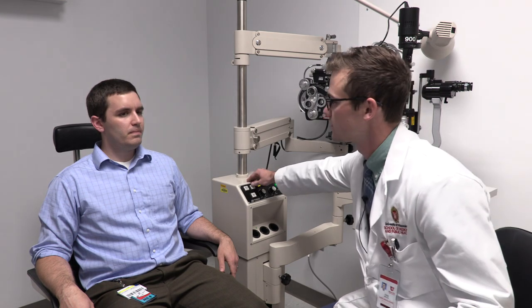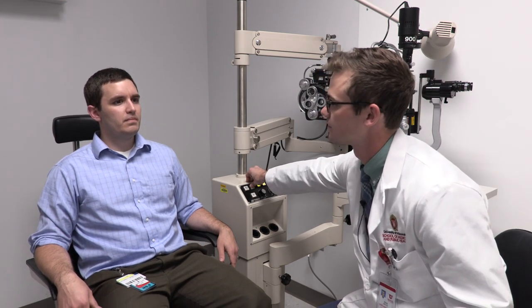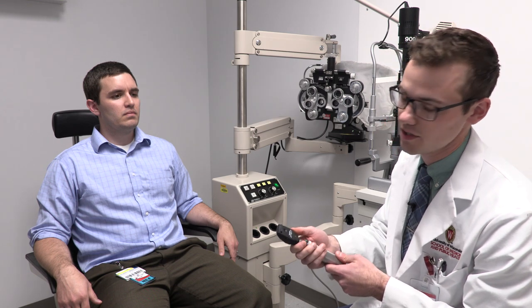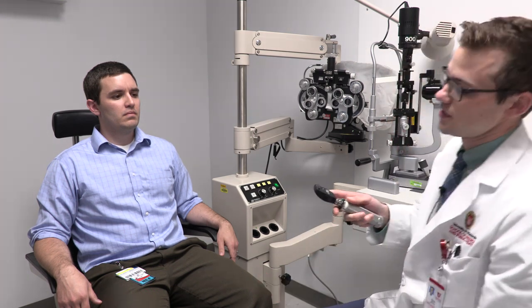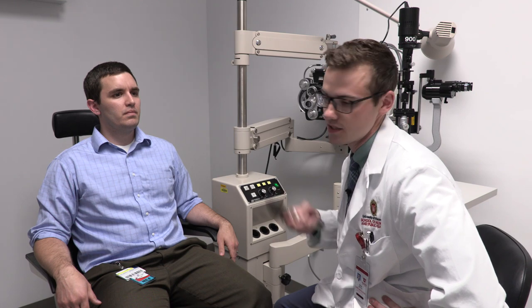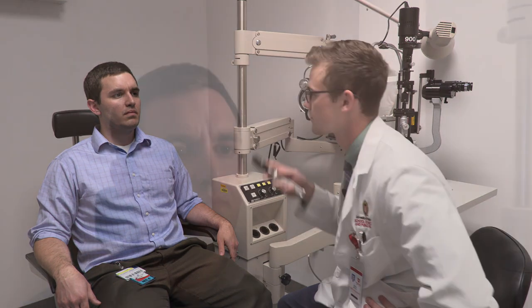Position the patient so his eyes are level with mine. Take your direct ophthalmoscope, switch it to the on position, and set the diopter setting to zero or to match your refractive error. Position the direct ophthalmoscope close to your dominant eye, then 12 to 18 inches away from the patient's eye. Direct the light source towards their eye and have them look towards the light. In a pediatric patient, it might be helpful to use hand motions or toys. Then shine the light on each eye individually and both eyes simultaneously to check for symmetry of the reflex.